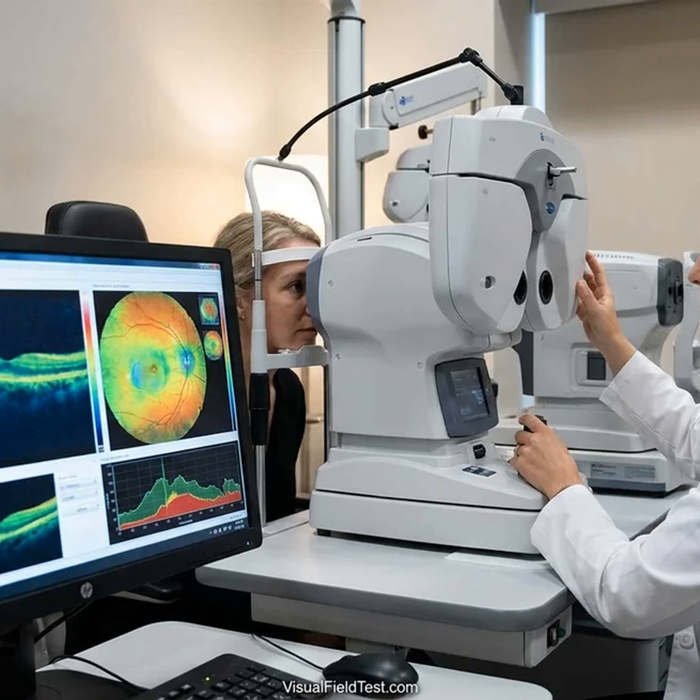Questions patients should ask about their OCT. OCT reports can be confusing. If your ophthalmologist tells you about an OCT result, here are some appropriate questions to clarify what it means for you. What do these colors, numbers mean? Ask the doctor to explain the report. For instance, if a quadrant of your RNFL map is yellow or red, ask if that is expected or a warning sign in your case.